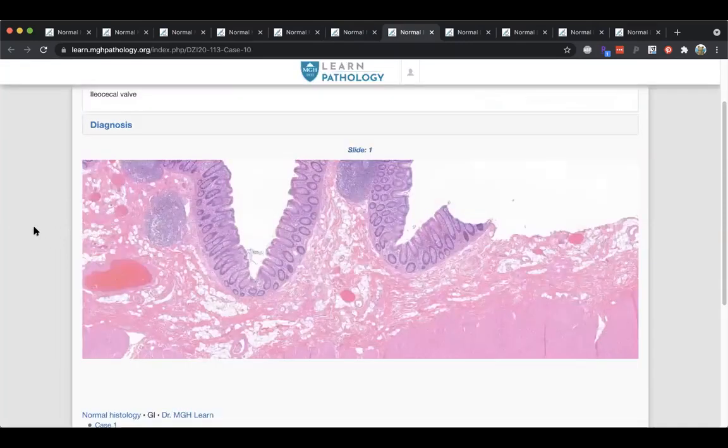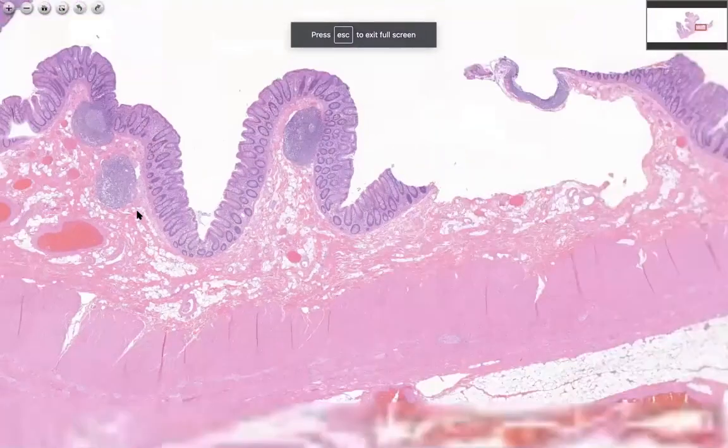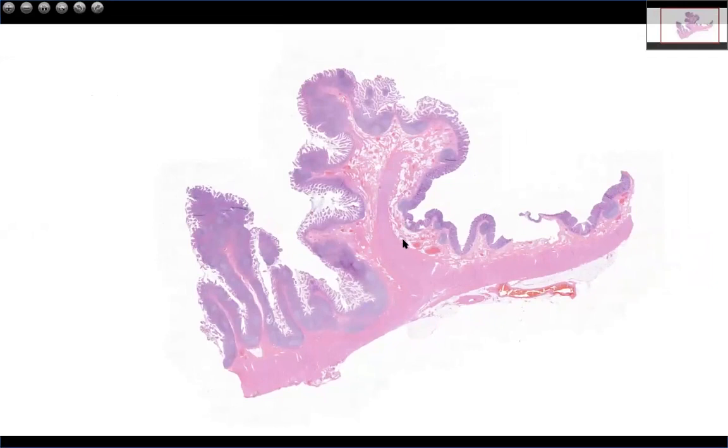All right, next we can go over the ileum, ileocecal valve, and then into the cecum, which is the first part of the colon. This is a beautiful full thickness section of the ileocecal valve. On the left-hand side here, we have the ileum. You can even see at this low power these blue balls, which are hyperplastic lymphoid follicles, also known as the Peyer's patches in the ileum.